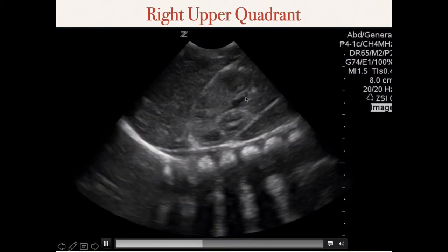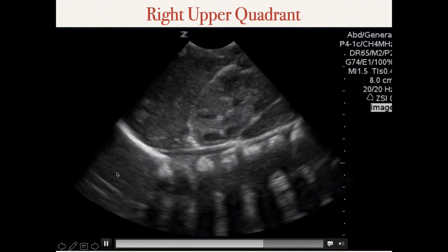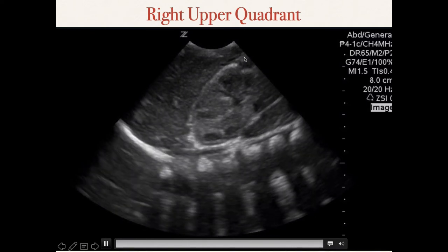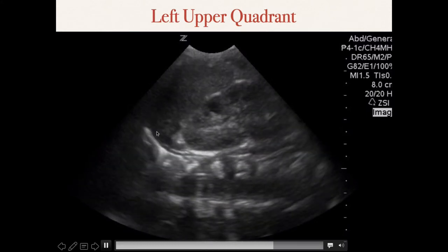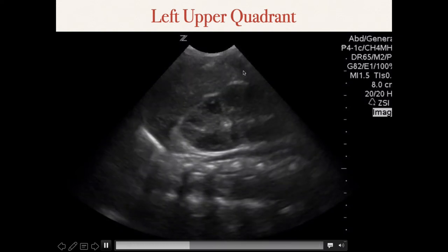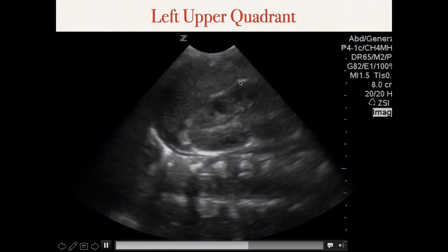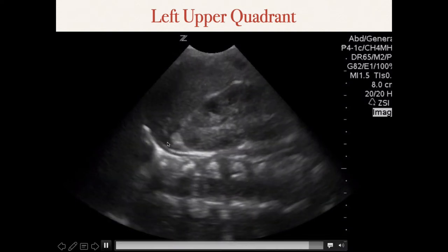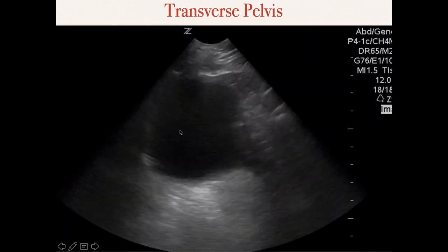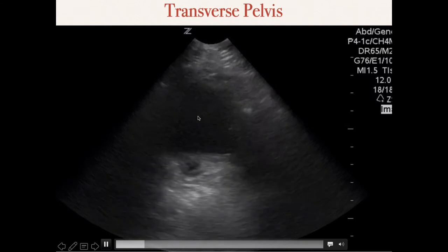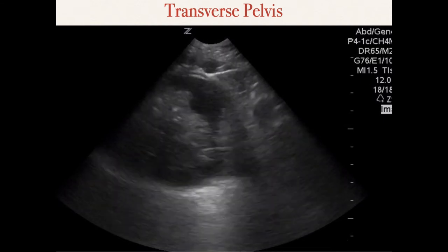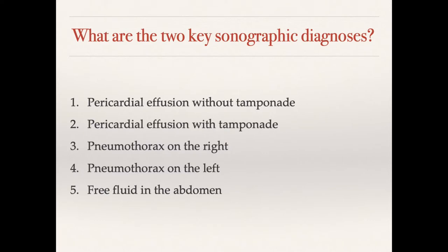Right upper quadrant shows liver, kidney, spine - no spine sign. The diaphragm ends right here, and there is no intra-abdominal fluid. Left upper quadrant shows spleen, kidney, spine, diaphragm - no spine sign, no hemothorax. Reviewing the bladder in transverse view, I'll call intra-abdominal fluid negative. So the two key sonographic diagnoses are pericardial effusion without tamponade and pneumothorax - on the right, it appears.